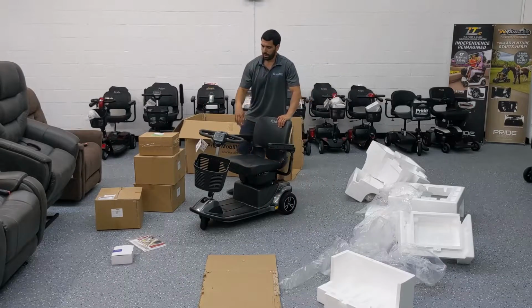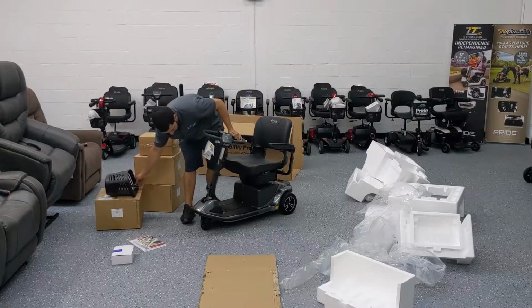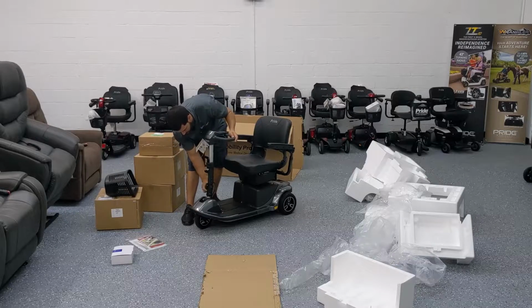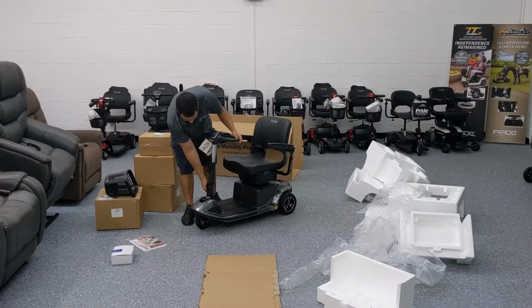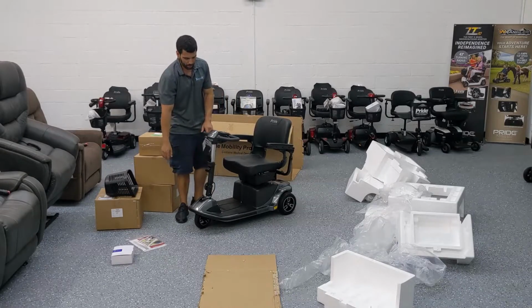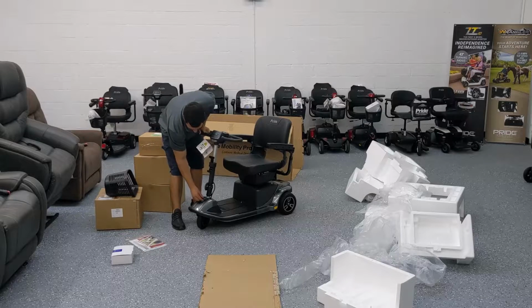It's in. Again, you do have this adjustment knob on the front. We'll take this out just for a second. This is to lower the tiller or bring it closer to you, or bring it out further, depending on the length of your arms. You may want to play with that a little bit until you get the perfect position there.